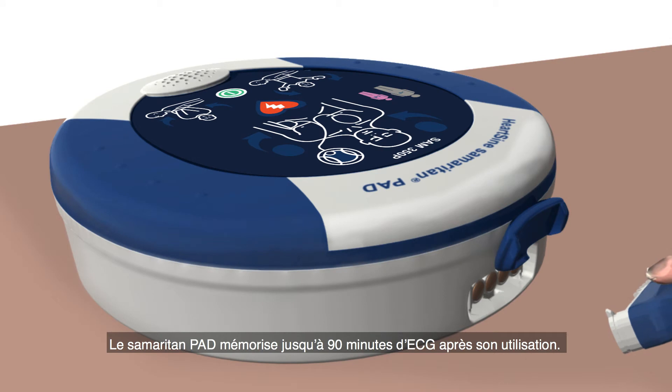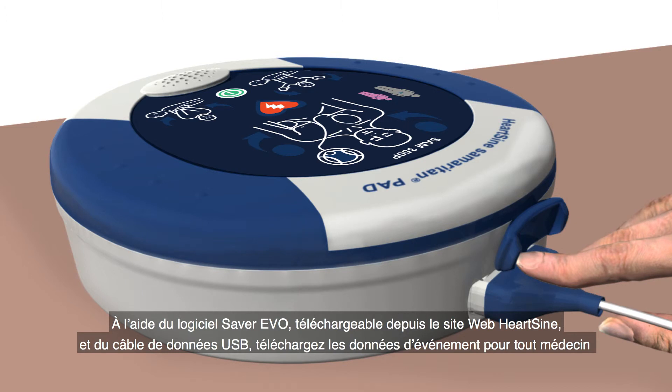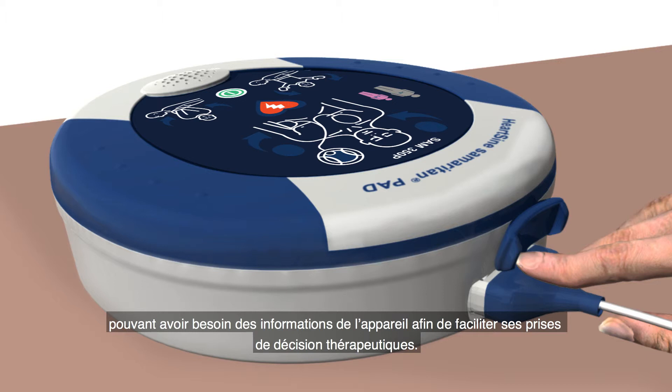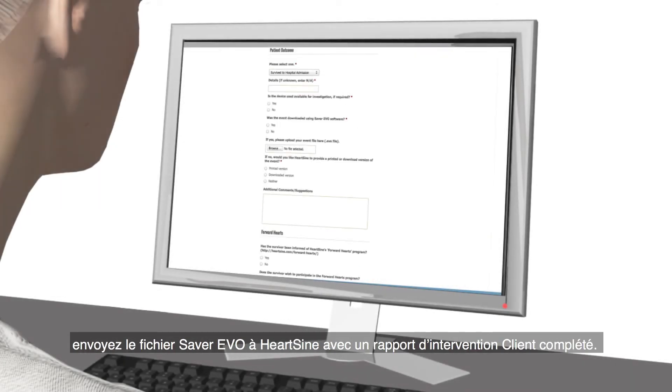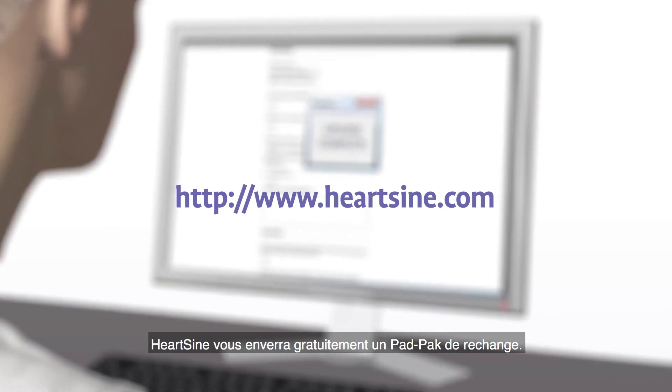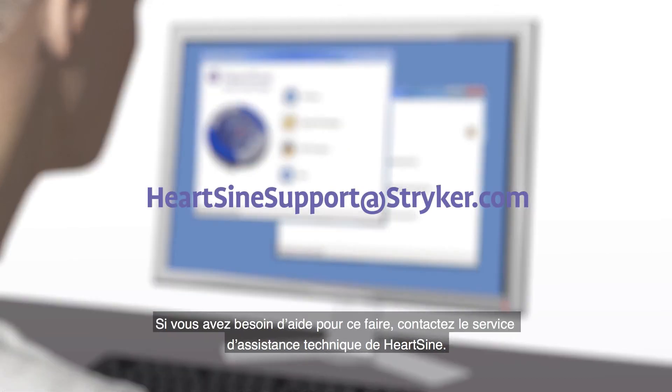The Samaritan PAD stores up to 90 minutes of ECG information after use. Use the Saver EVO software, which can be downloaded from the HeartSine website, and the custom USB data cable to download the event data for a physician who may want the information to help inform treatment decisions. After using the Samaritan PAD during a sudden cardiac arrest, submit the Saver EVO file and a completed customer event form to HeartSine. HeartSine will send you a free replacement pad pack. After downloading the event data, please erase the data from memory. If you need assistance to do this, contact HeartSine Technical Service.